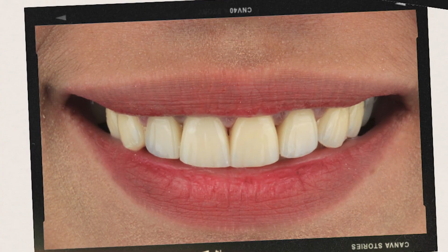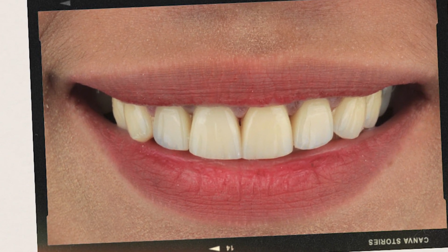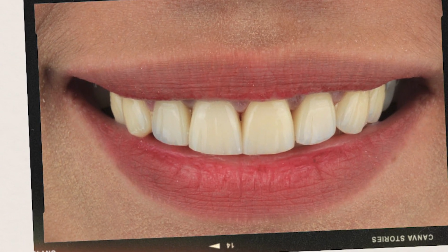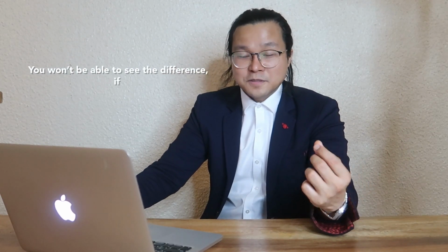And also the collapsed premolars look way better because we added volume. Also, it looks really natural na ngayon. So during that try-in, Ivy actually was amazed at the result kasi she's expecting that the crown is a bit bulkier than the veneers. So hindi niya inaakala na it would be the same, na identical to each other, that it looks really natural. So that's one of the tricks now in ceramics. You won't be able to tell if it's veneers or crowns.